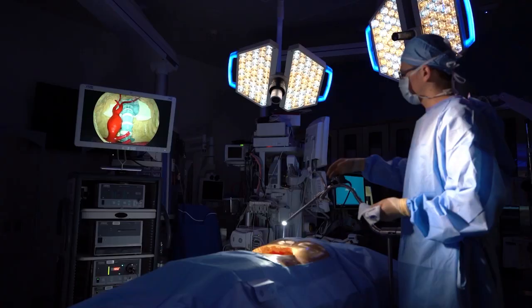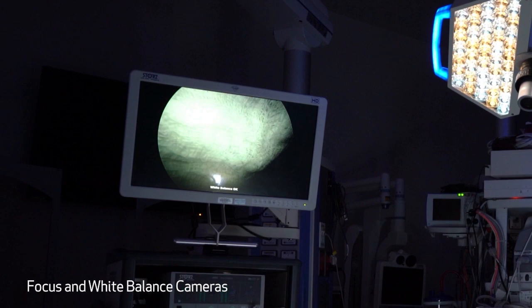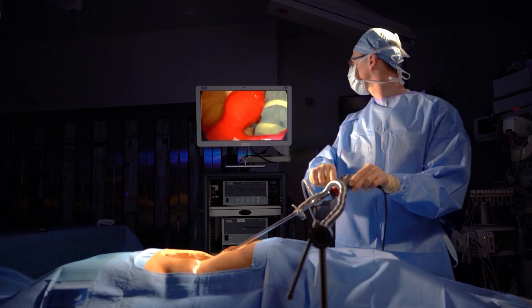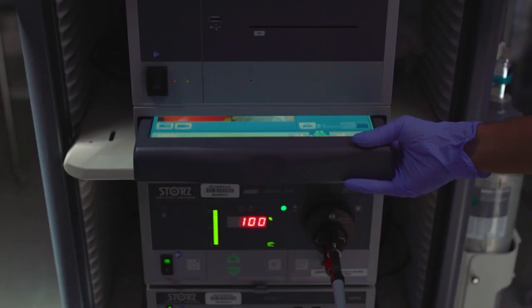The first thing you want to do is focus and white balance — exactly the same as the laparoscopic setup. Here we're white balancing, adjusting the field of view, and then focusing. There is also an autofocus component which can actually be utilized.